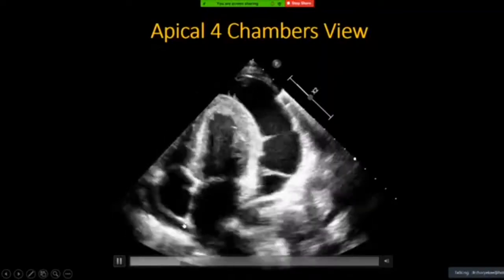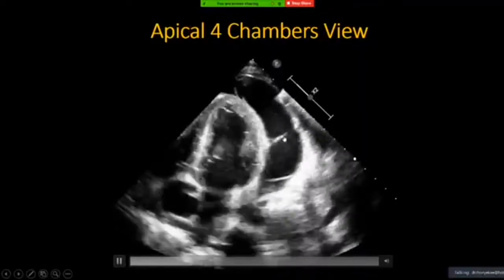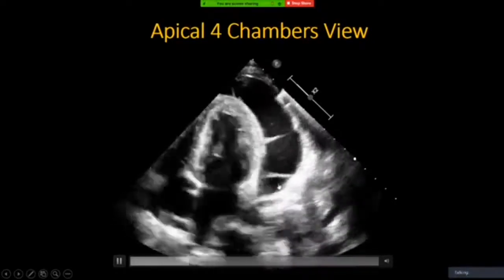What is special is that there's a lot of spider web-like material around the pericardial effusion. And when you look carefully, the fluid here is not clear. There are a lot of particles inside, so it's suggestive of exudative fluid with some fibrin.